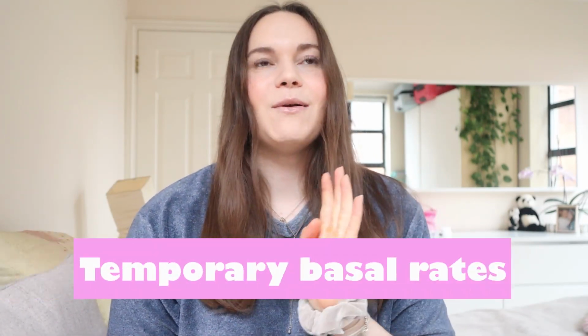The very first thing that I have to mention is, of course, temporary basal rates. I love using temporary basal rates. I use them several times a day. If you're unsure what a temporary basal rate is, it kind of does what it says on the tin. It's essentially where you have your normal basal profile and you can increase that or decrease that by a certain percentage over a time frame that you decide.